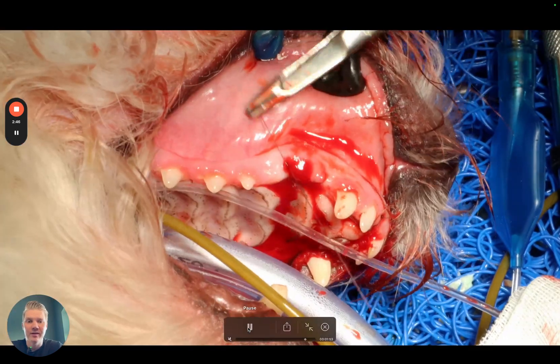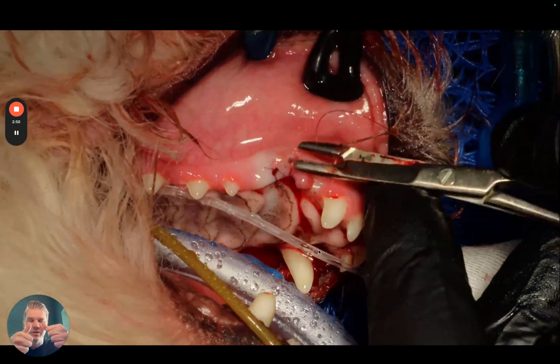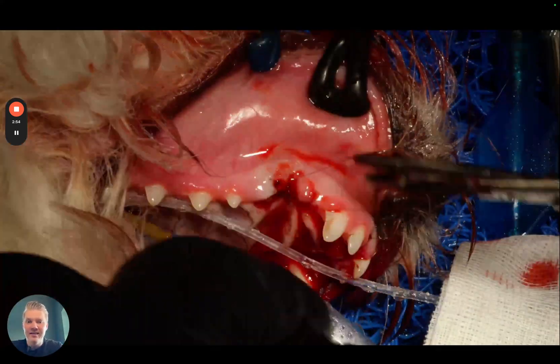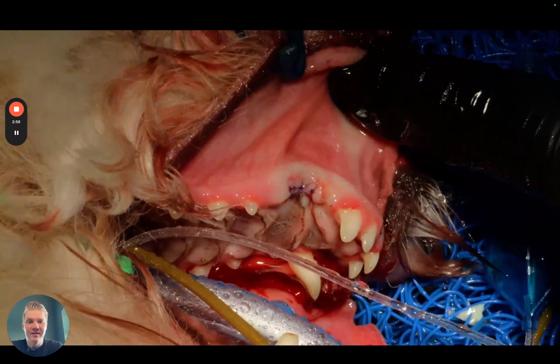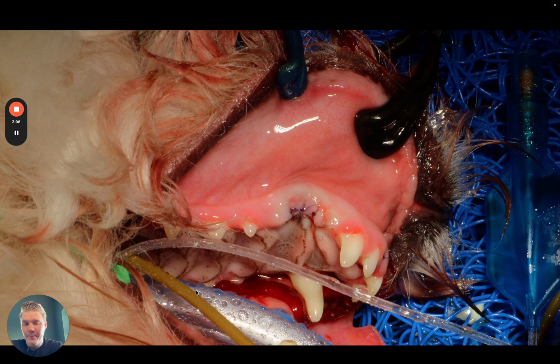If you have problems with getting things approximated, you can take your fingers and push a little bit on either side to make the edges meet. And this will, per definition, not dehisce, because I didn't make any flaps, so there will be no dehiscence. I didn't make any cuts and the releasing of the periosteum — that will reduce pain. And I didn't have to suture all the way here, so I also saved some time.